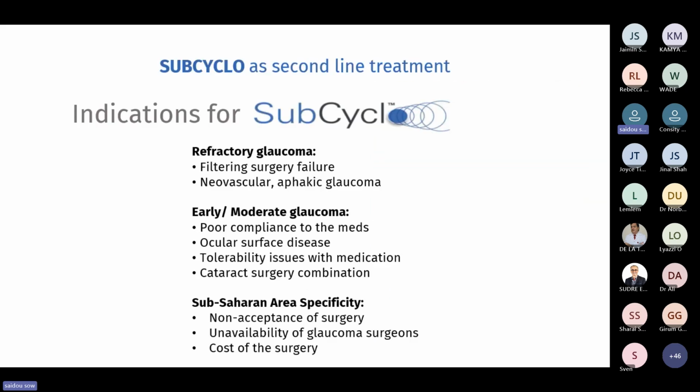So what are the indications for Subcyclo? It can be refractory glaucoma, in case the filtering surgery has failed, a neovascular glaucoma or aphakic glaucoma. In early or moderate glaucoma, in case of poor compliance to the meds, we can propose Subcyclo. In case of ocular surface disease also, or tolerability issues with the medication, or sometimes in combination with cataract surgery, we can also propose it.